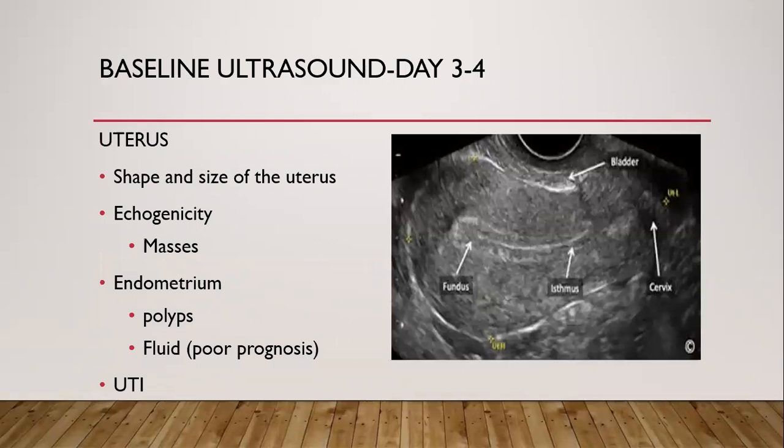Okay, so let's look now at the actual scanning. I indicated earlier that there are three ultrasound stages. I would call them stages.